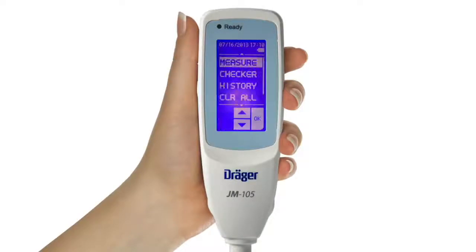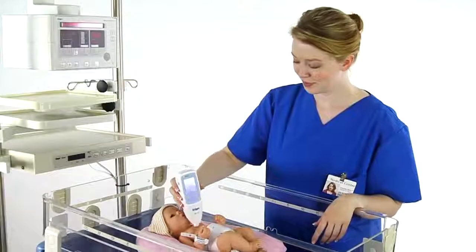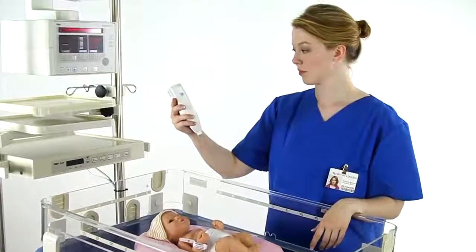For example, if your JM105 is configured for 5 readings, when you press Measure to start the measurement process, the screen will display the words AVE5 to remind you that 5 readings must be taken. When the ready light is illuminated, take the first reading.